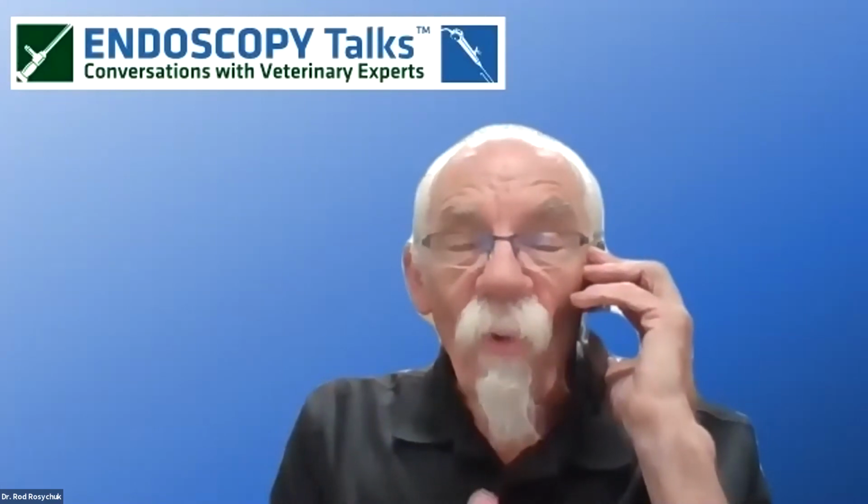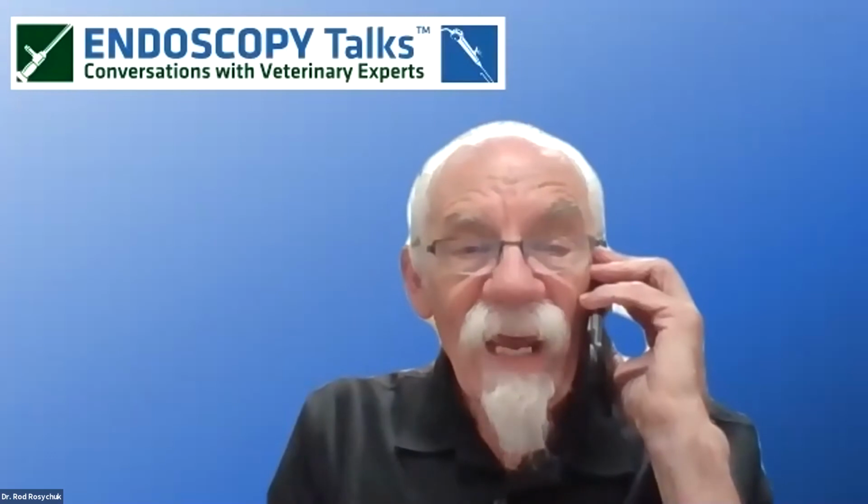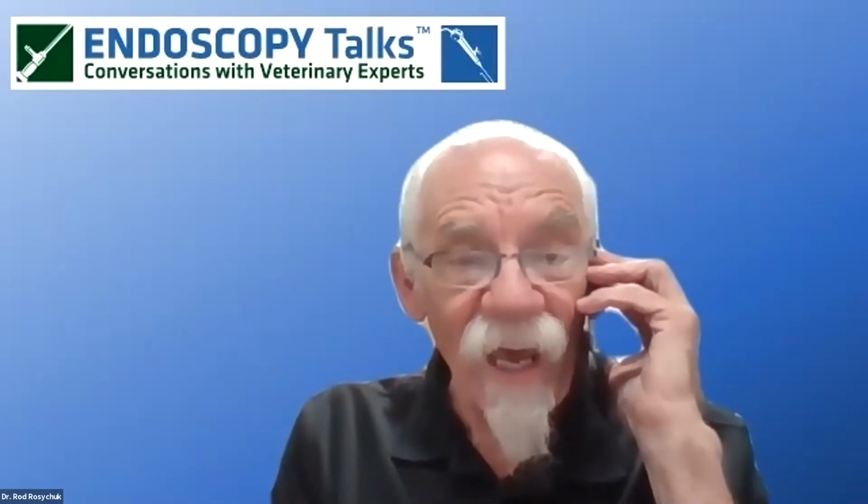I think if you work at cleaning the ears the way I've just talked about, you shouldn't be up against that wall in most ear cases. You'll get to the tympanum. You will appreciate it. You will get there and see it.